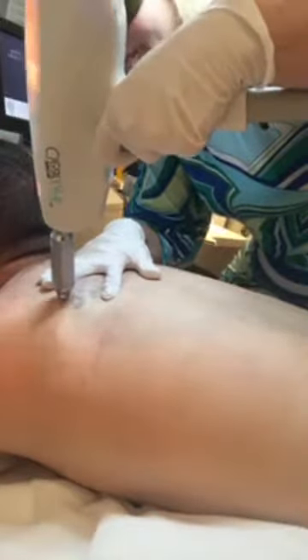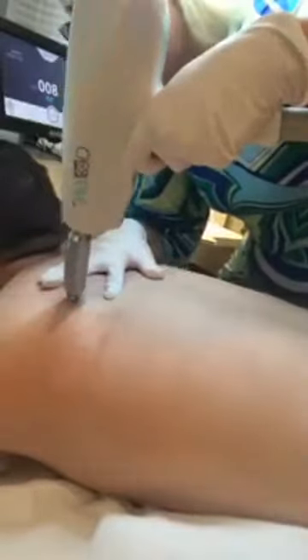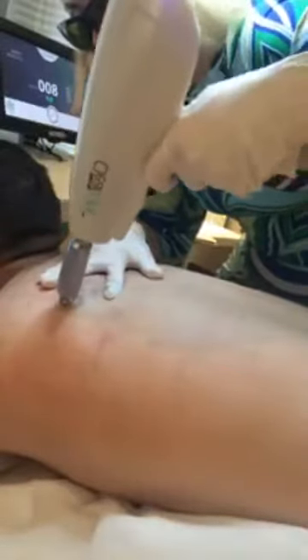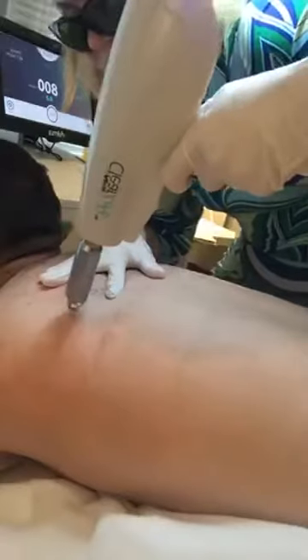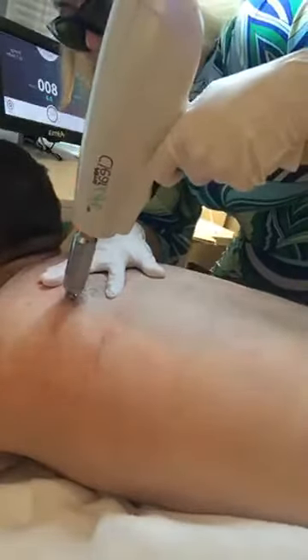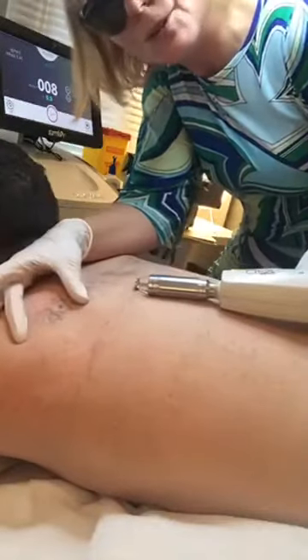I have my laser all set and ready. I'll start on this side first where you can see on camera and then finish him up afterwards. What we do is trace around the little letters — the outline — and what I'm trying to do is white out and get a blanching effect of the ink. When we do that, we know we have enough energy level. You can see on the letter the half that I've done has blanched quite nicely.